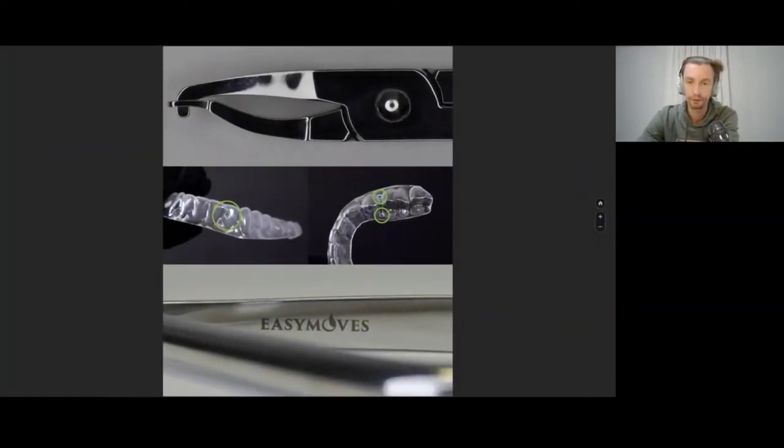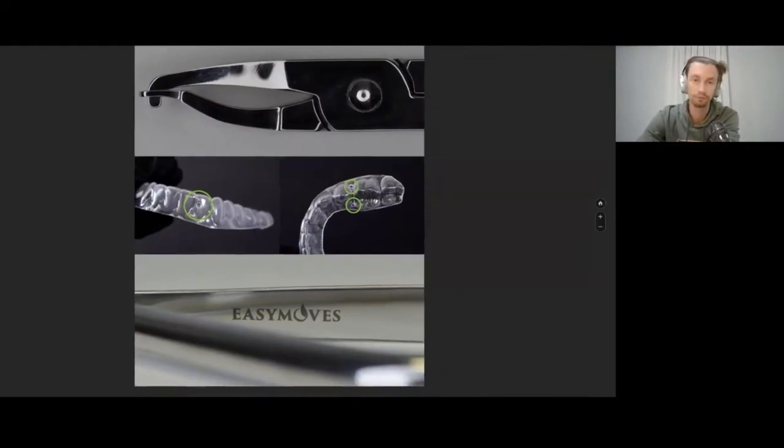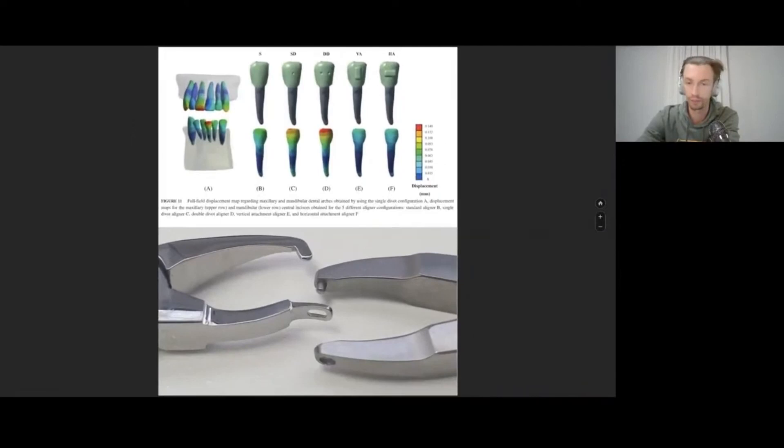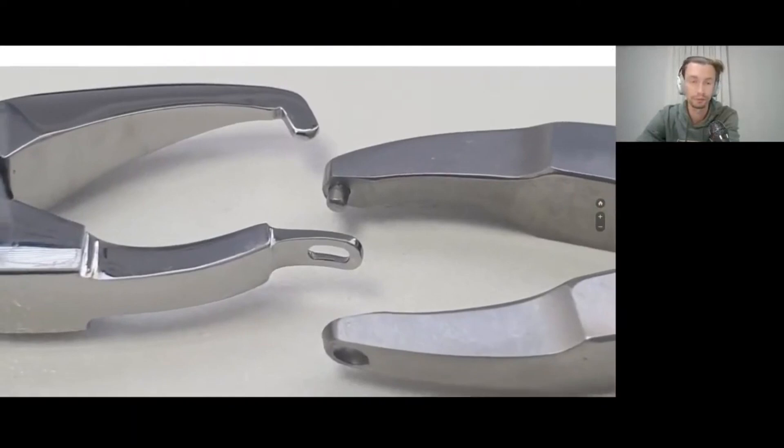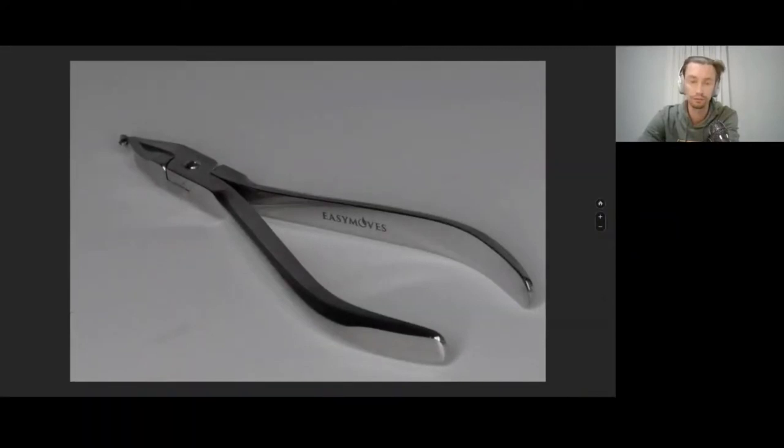I ordered the pliers from my own design — I ordered them in Pakistan. These are my personal design of the pliers. I ordered two types. I like better the pliers on the left side — these are the pliers with a vertical active surface. Research on biomechanics shows that the inclination of the crown will be more intensive if we add this kind of indentations, dimples, in the aligner. So pliers are a very important instrument in the hands of the orthodontist working with aligners.